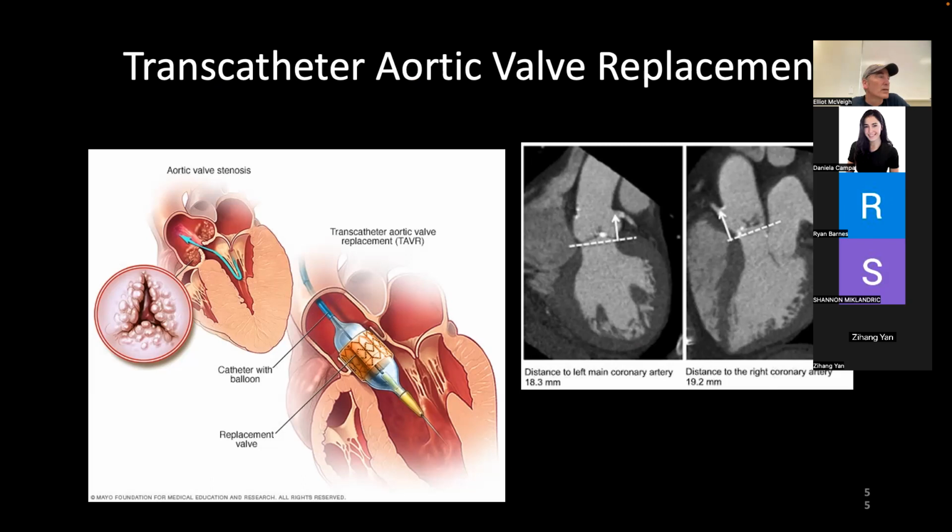Is that lab generally run by the hospital or by the TAVR company? So the question is, who runs the lab that analyzes this? That can be either the radiology department itself has a 3D lab, and that goes into part of the billing, is that you have this analysis post imaging, or if it's a cardiology group, they can do it themselves, right?